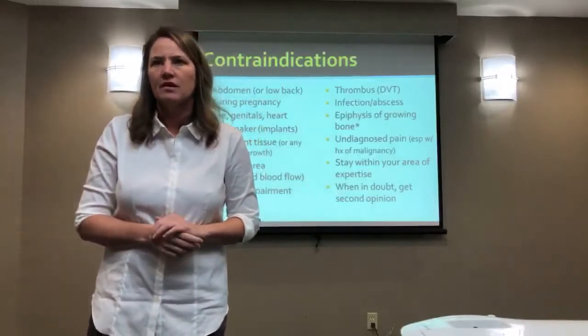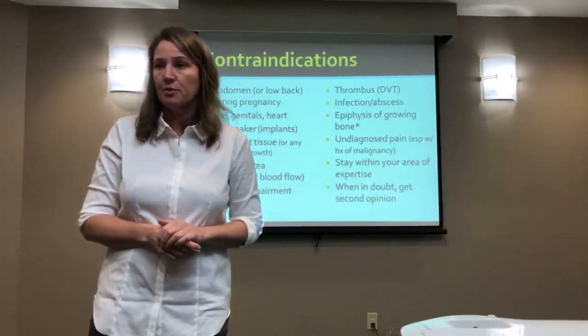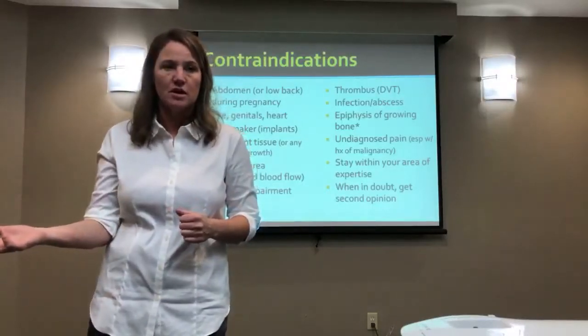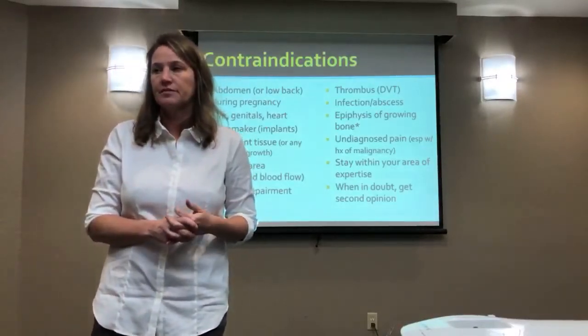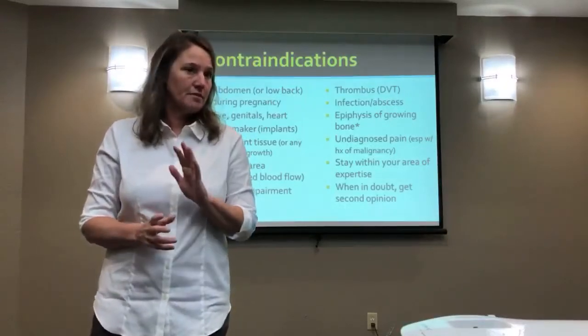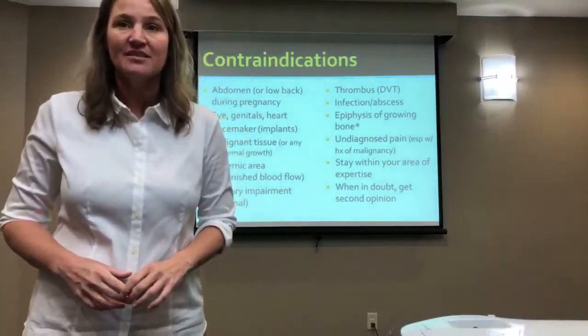And that's where I don't know if that's being done. I don't know of any physical therapy or occupational therapy clinics that are delegating it to non-licensed individuals. But I hear a lot about other clinics that are. And laser treatment is delegated to non-licensed people too, but that's a whole tangent issue.